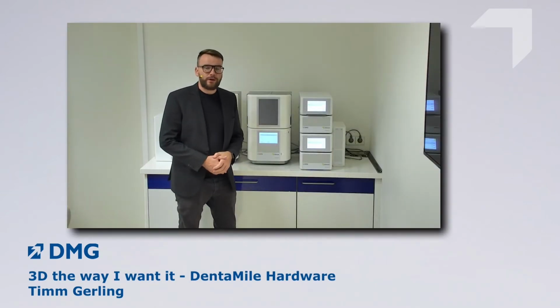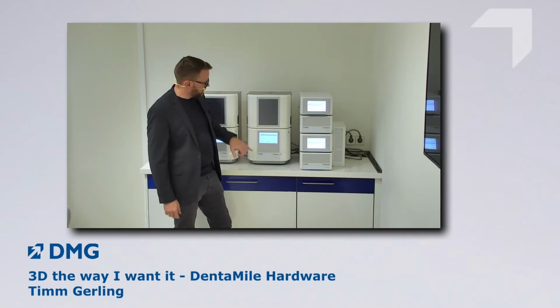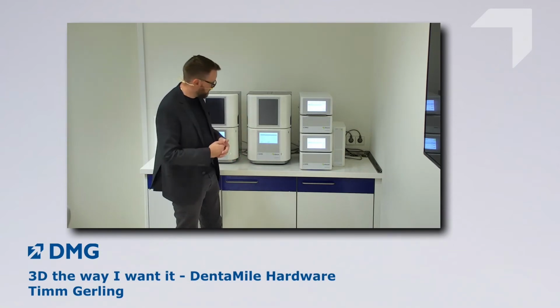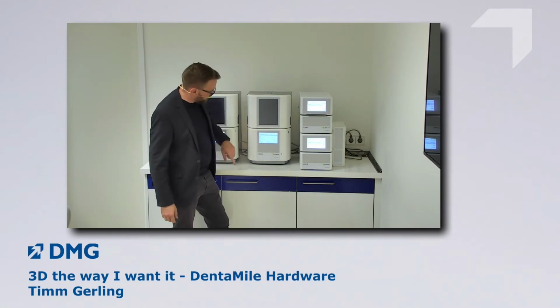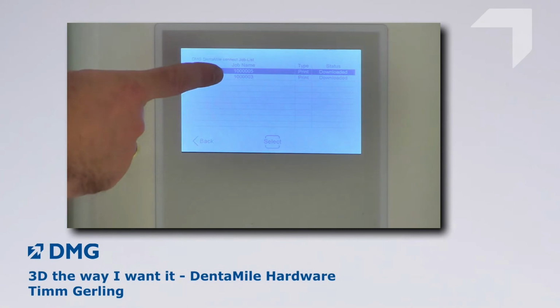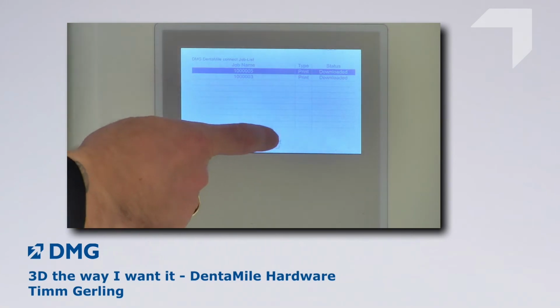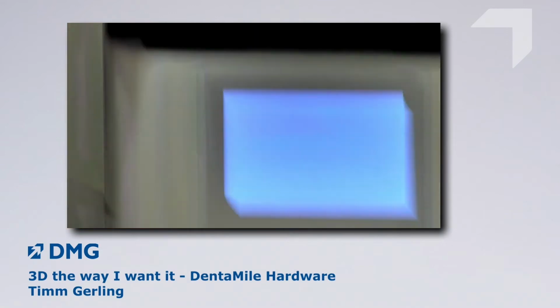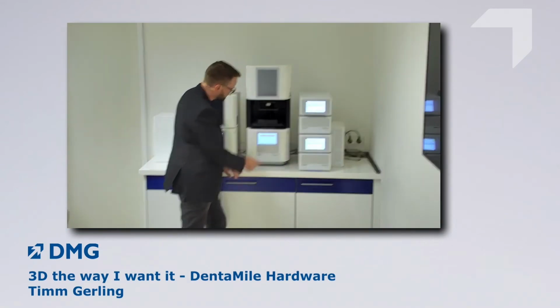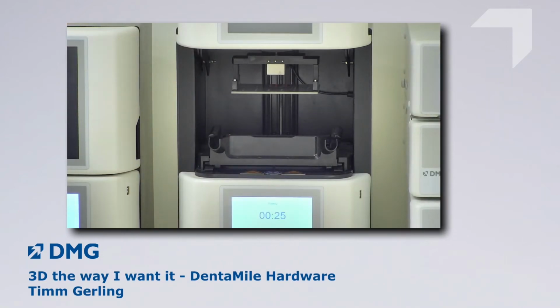Yes, so now here we are on our 3D printers. I've just transferred the printing job of the bleaching splint that we've just created to this 3D printing device, and now I select the print file and hit the start button, and the 3D printing process will immediately start. So the platform is going down into the reservoir and starts the printing job.